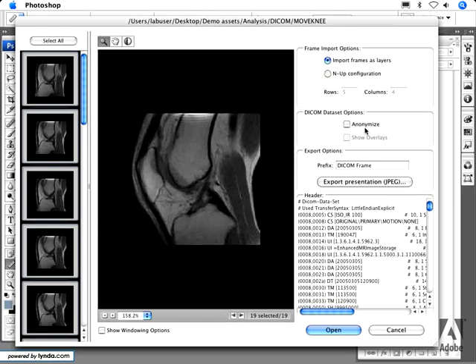You can also anonymize the DICOM data. Photoshop will go through the DICOM header and scrub out all of the patient information contained within the header, such as patient name, patient number, etc.